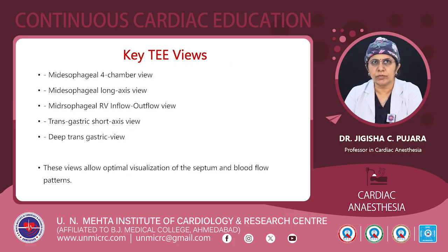Key TEE views for the VSD assessment are the mid-esophageal four-chamber view, mid-esophageal long axis view, mid-esophageal RV inflow-outflow view, transgastric short axis view, and deep transgastric views. These views allow optimal visualization of the septum and blood flow pattern.